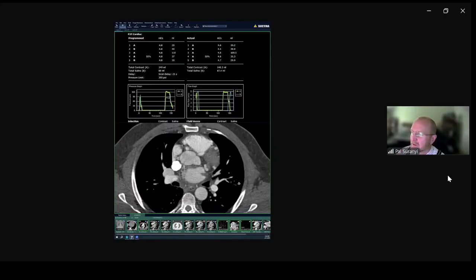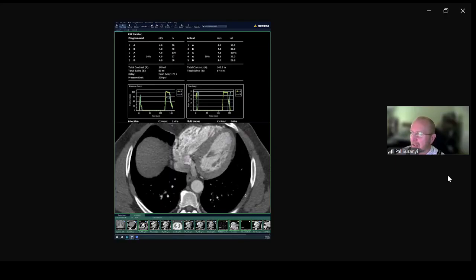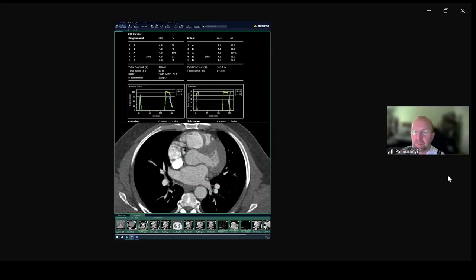Yes. So this was sort of completely incidental. I think the patient had chest pain, and had some head injury. So maybe he passed out or something. This was a case from actually 2012.